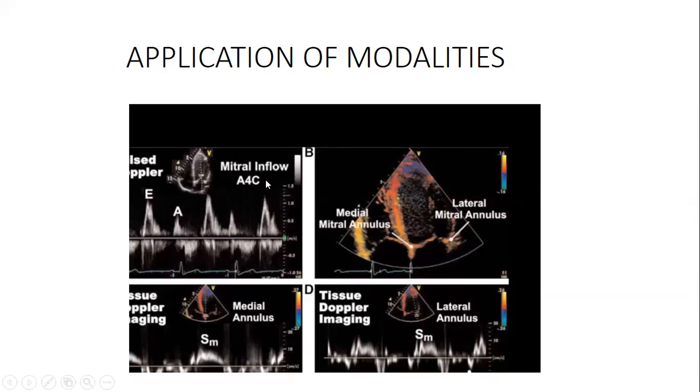Since the machine has reached the Nyquist limit where it can measure, it will envelope, and it will appear as a negative. For example, if this one measures up to here and there is anything remaining, maybe a tip like this, you are going to see this tip down here.